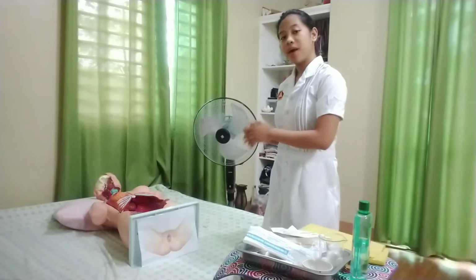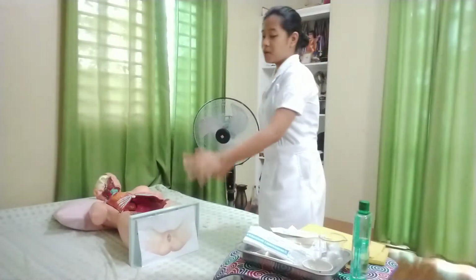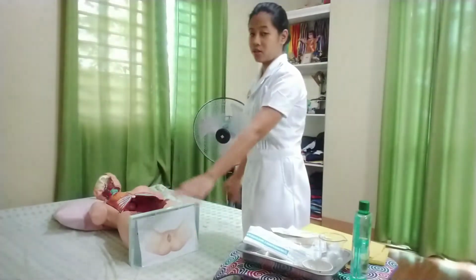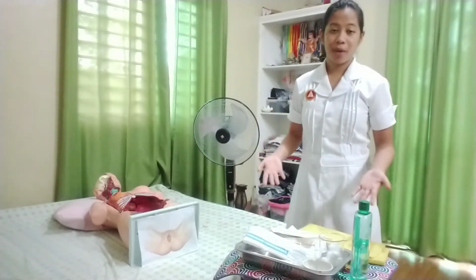Now I will be assisting my client into a proper position for the catheterization. For a female client, it should be dorsal recumbent position with knees flexed and the feet 2 feet apart. And for a male client, it should be a supine position with legs slightly abducted. So assuming that my client is already in a dorsal recumbent position with feet about 2 feet apart, I will now start cleaning the genital and perineal area using soap and water. After that, I will rinse, dry, and perform hand washing again.